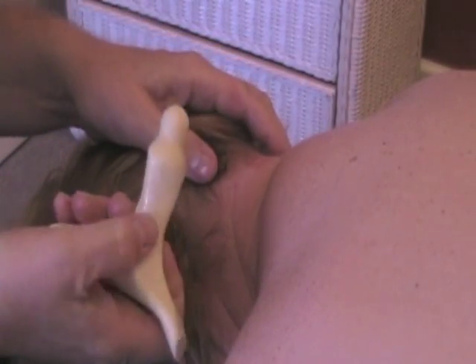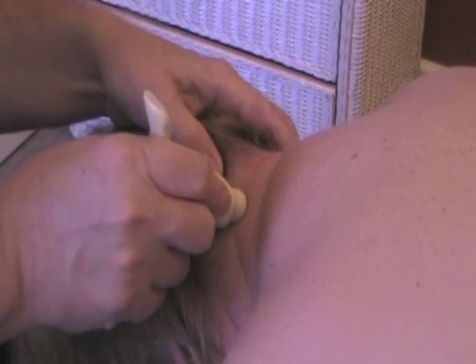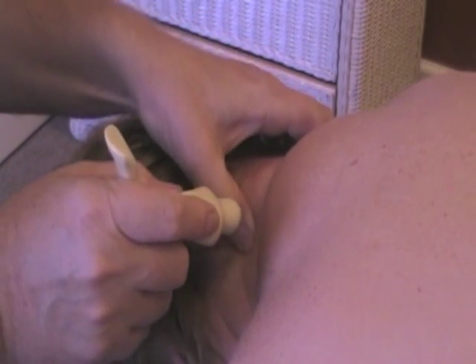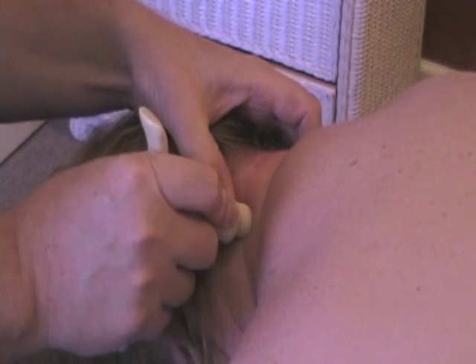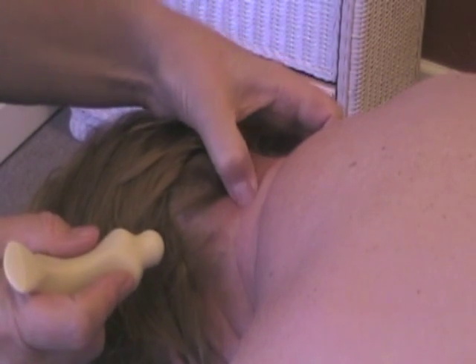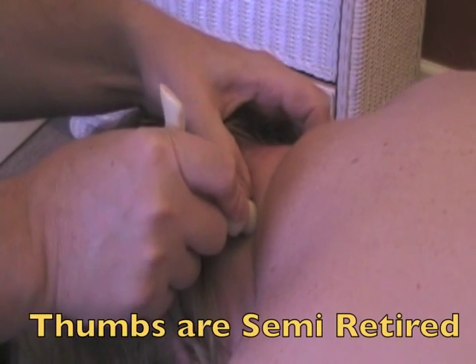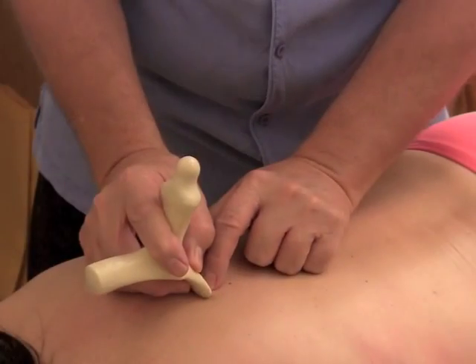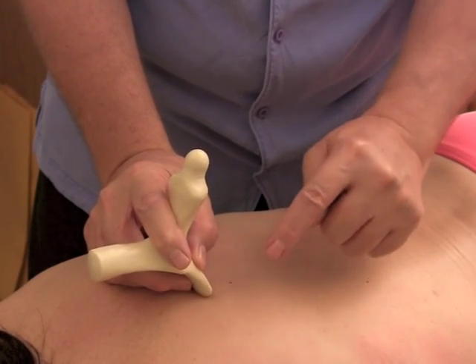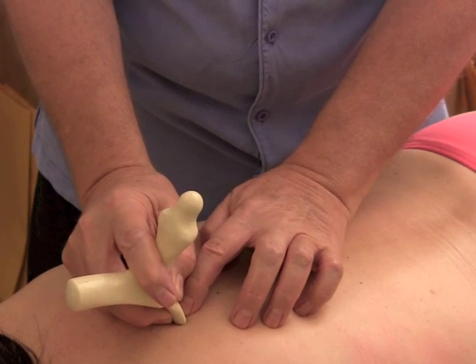Now I'll turn the tool over and use the ball in the laminar groove. Notice how I'm using my thumb of the other hand to stabilize the tip — it's feeling the spinous process and holding the laminar groove in exactly the position that I want it in. Both hands are in complete contact with the patient at all times for virtually all of the therapy. The thumb is palpating and feeling where the tool should go and then helping guide it, doing none of the work other than just palpating. These spinous processes are coming out and heading a bit inferior, so I'm going to slide in in this direction and I can feel right through the tool — there's the area right there.